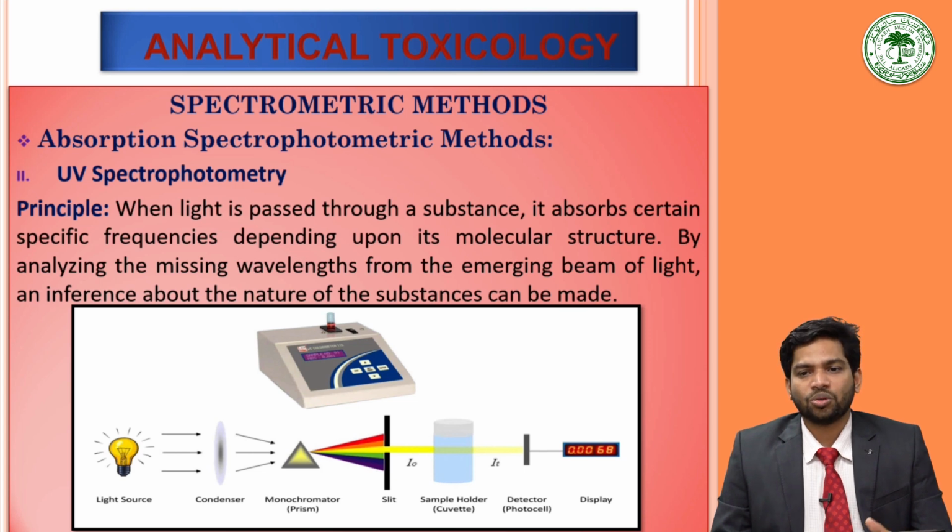Monochromator can be set up so that it sequentially allows UV rays of all wavelengths. Transmission of each wavelength is recorded by the photocell. A spectrum is prepared from the resultant data which can be studied to derive the chemical composition of the sample. UV spectrophotometry is mainly used for quantifying the blood levels of drugs like paracetamol, salicylates, and the urine level of phenothiazines compound.